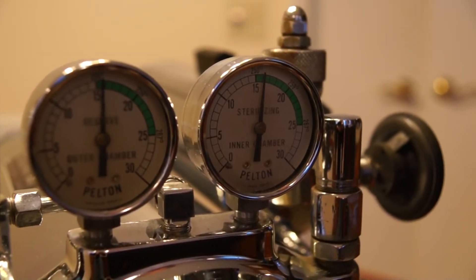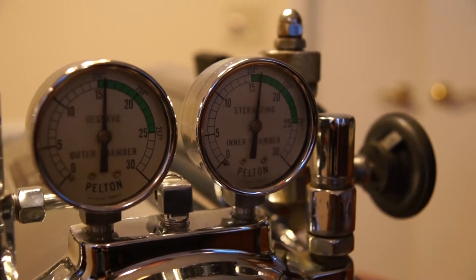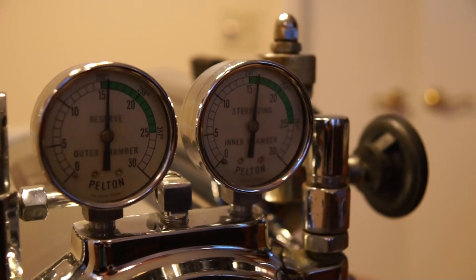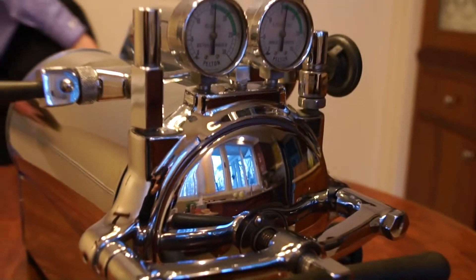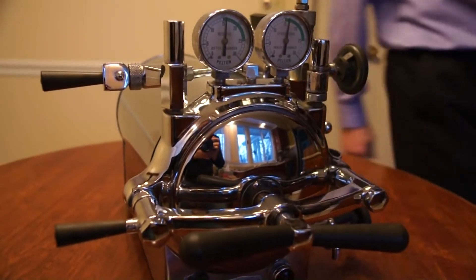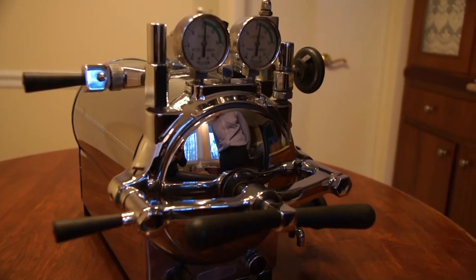We've reached the end of our sterilization. We've been at 16 psi for about 30 minutes, so we will turn the power off at this point. Power is off, as you can see by the red light — it is no longer glowing.